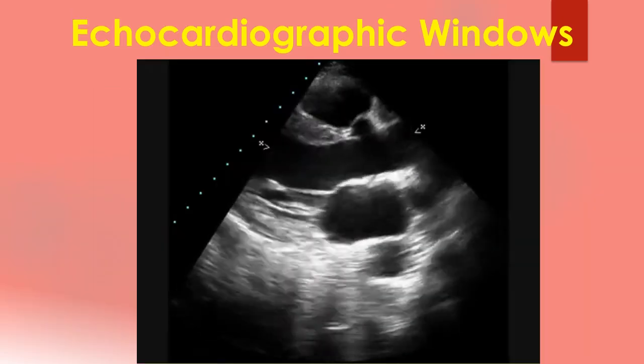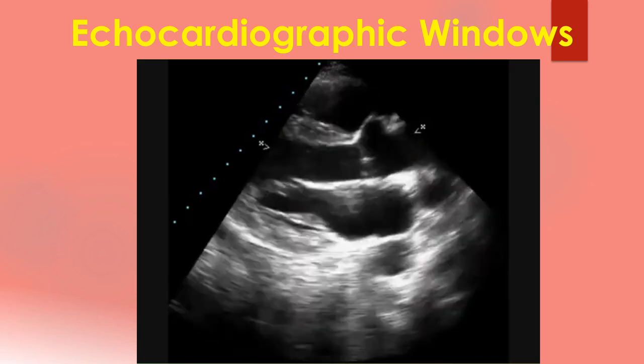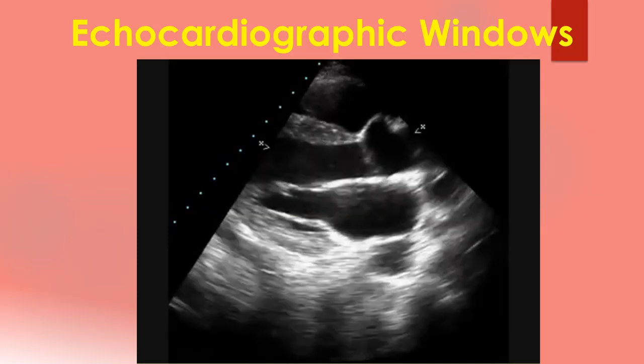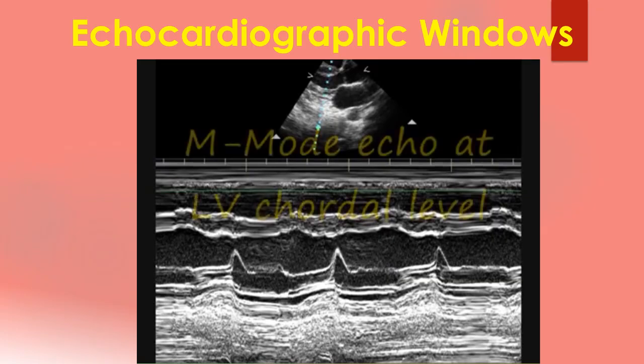An annotated video of normal color Doppler echocardiogram illustrating various views and an M-mode tracing is shown here. Initially, there is a two-dimensional view from parasternal long axis view followed by color Doppler and M-mode. Parasternal short axis view, apical 4-chamber view and suprasternal view follow.